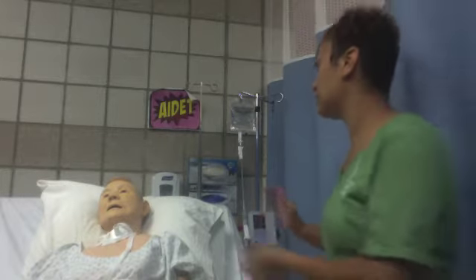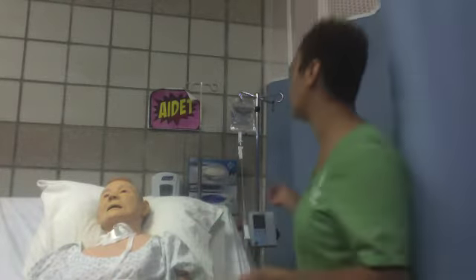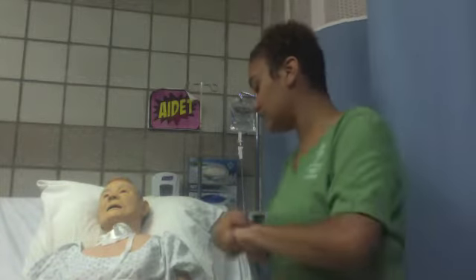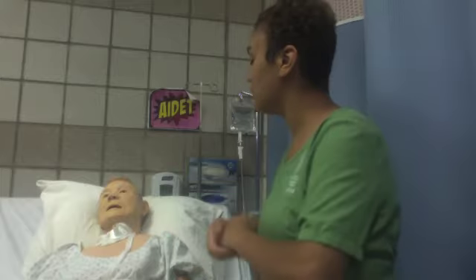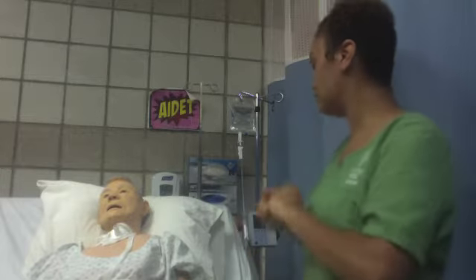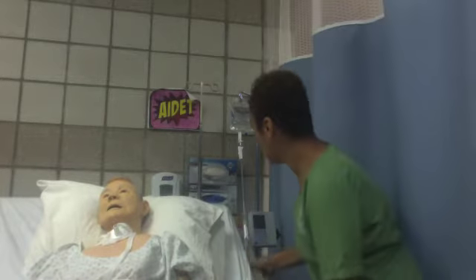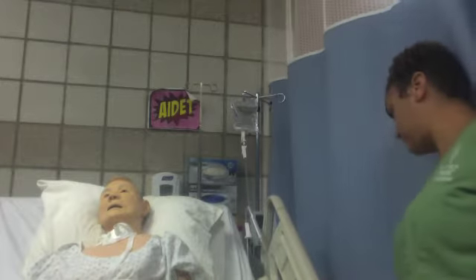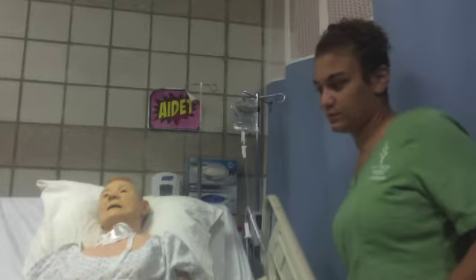Okay, so now I'm going to deglove and perform hand hygiene. All right, I've already done my vitals. I've looked at and asked about any redness, swelling, painfulness, itchiness, rash. There was none. Okay, I'm going to go ahead and raise this back up. And I'm going to bring you back down, okay? To a safe level.